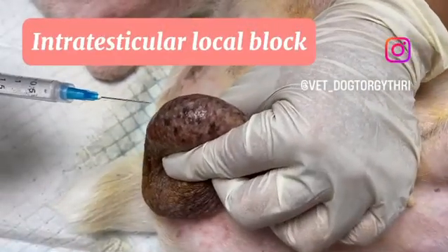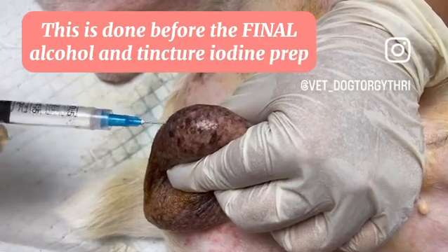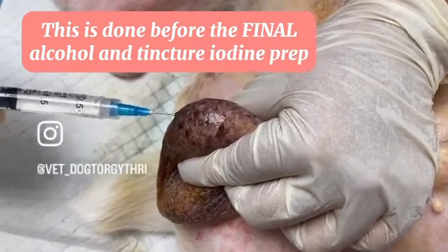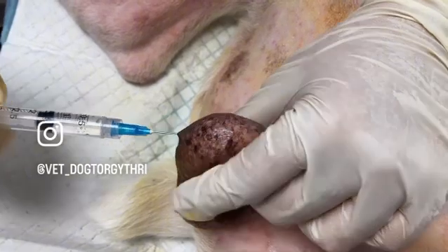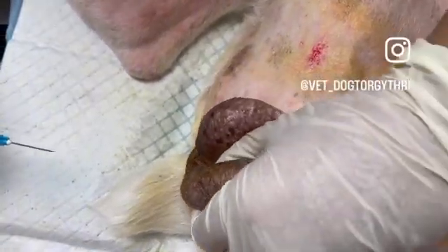Today I'm going to show you how we do an intratesticular local block for dogs before castration. First, we secure the testicle and then insert the needle midway into the testicle. We aspirate before we inject the drug. Then we repeat the same procedure on the other side.